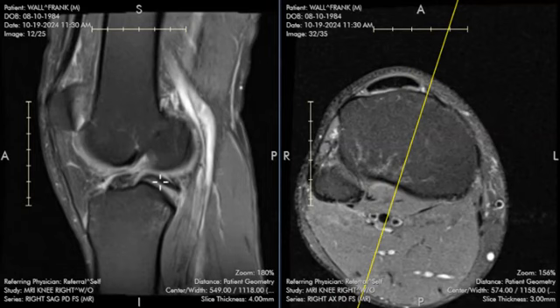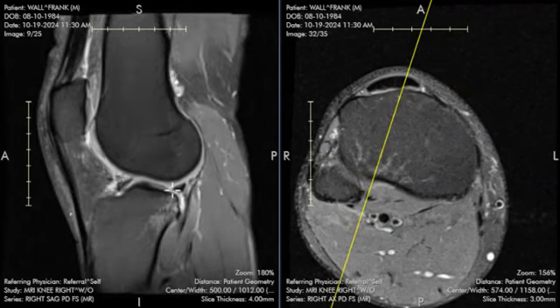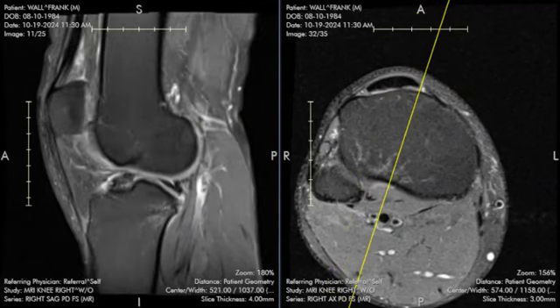This can occasionally cause people's joint to catch, like it's locking. It won't let you complete full range of motion, and it's something that an orthopedist will want to know about.